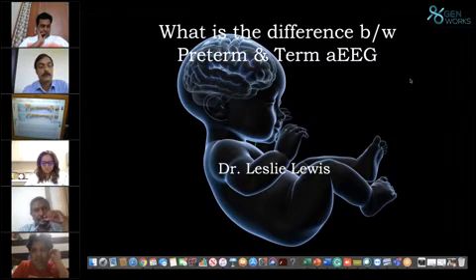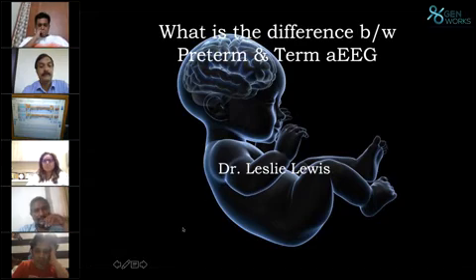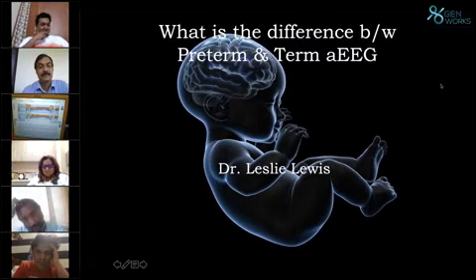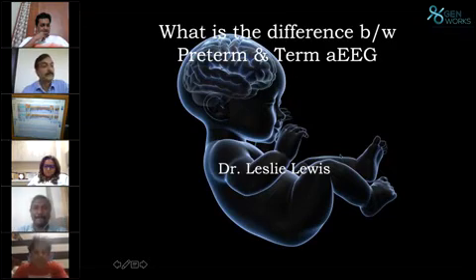I request only one thing. Many people are thinking AEEG machine is only for HIE. It is not so. Please, my dear friends, it is not only that. Somebody was asking me, Dr. Dinakar, when we are doing hypothermia, anyhow we know that up to 2 or 3 days seizures will come. Later it will burn out. Why do I need AEG? Why should I spend money? It is only for term babies.